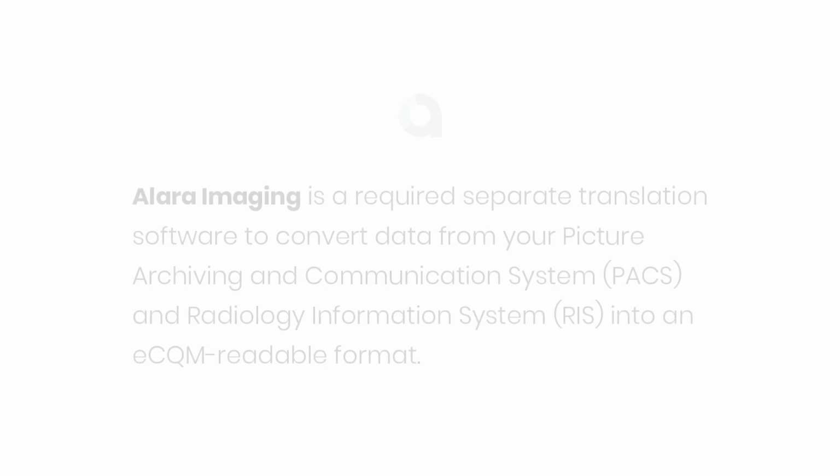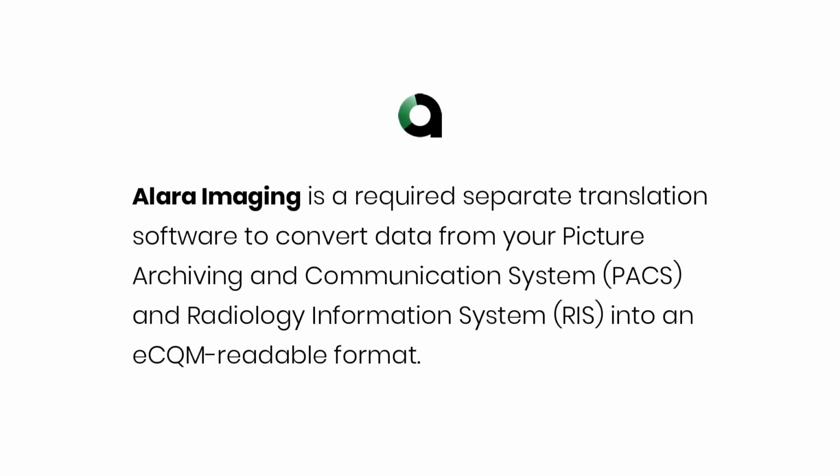Now, something to note is that for the very first time, a separate translation software is needed to convert that data from your PACS and RIS systems into an eCQM readable format. To do that, you'll need to install this free software from Alara Imaging Software.